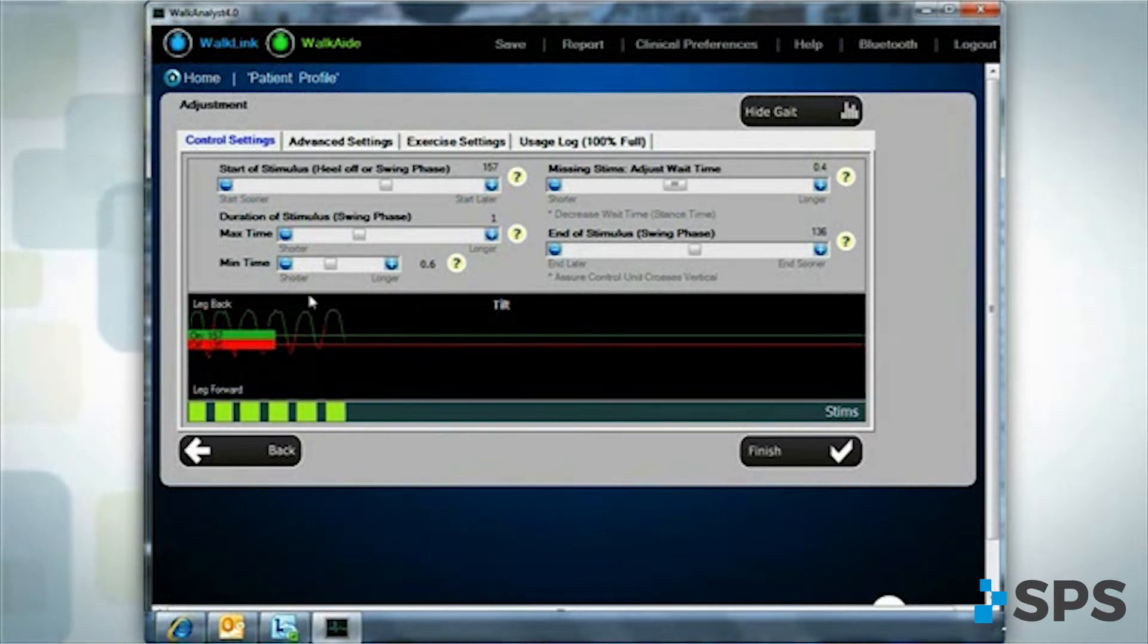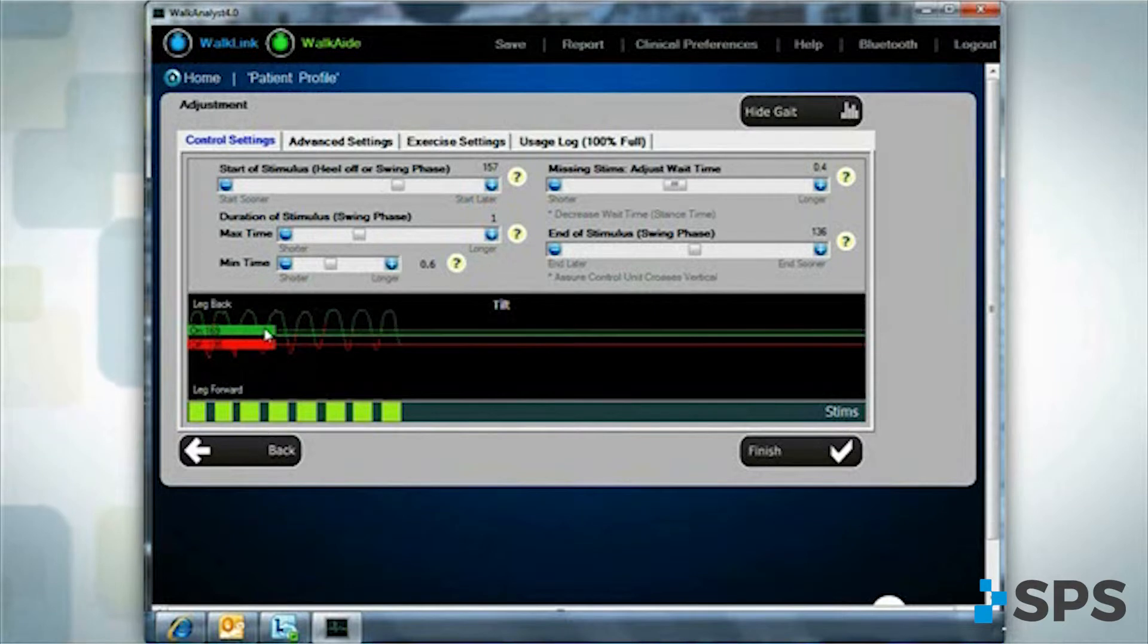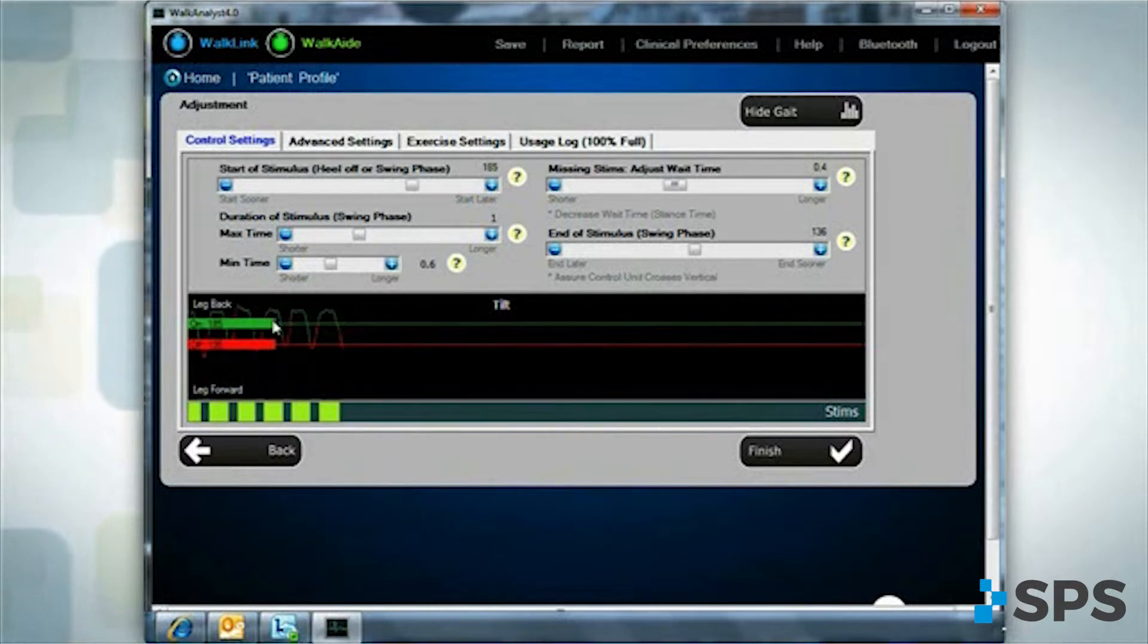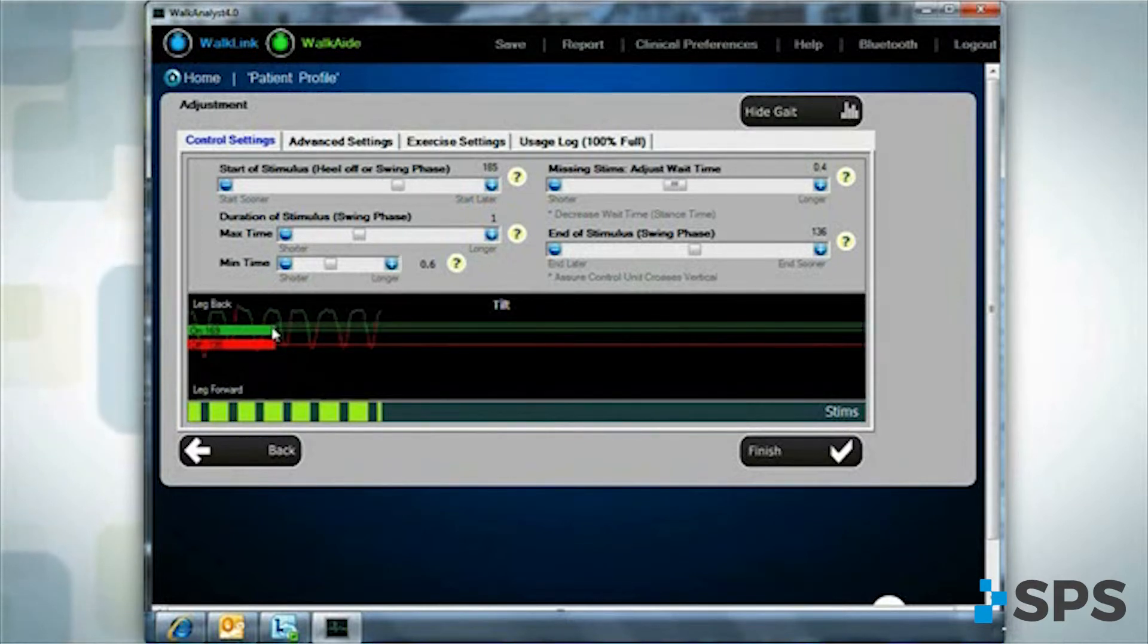If the stimulation starts too soon, raise the on threshold. If the stimulation starts too late, lower the on threshold.